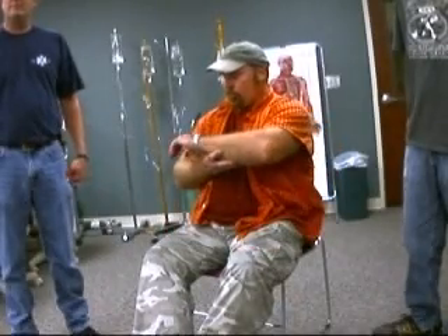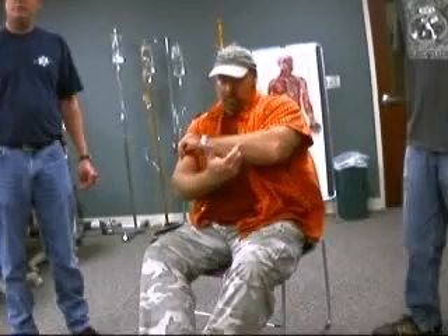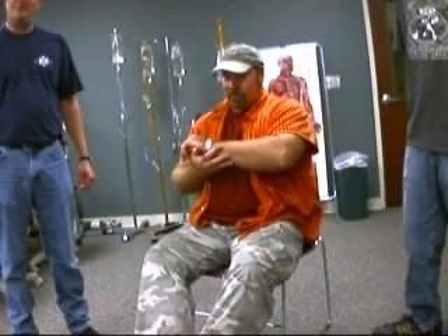This station is designed to test your ability to properly immobilize a closed, long-bone injury. You are required to treat only the specific, isolated injury. The scene size-up and initial assessment have been completed, and during the focused assessment, a closed, non-angulated injury of the radius and ulna was detected. Ongoing assessment of the patient's airway, breathing, and central circulation is not necessary. You may use any equipment available in this room. You have five minutes to complete this procedure. Do you have any questions?